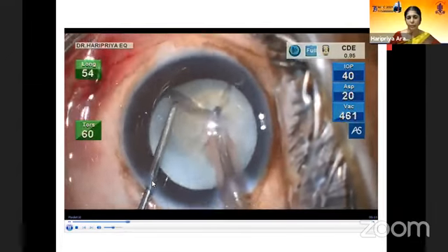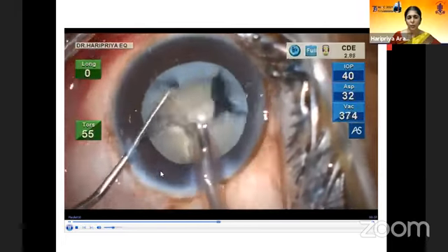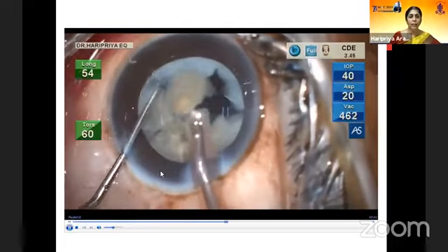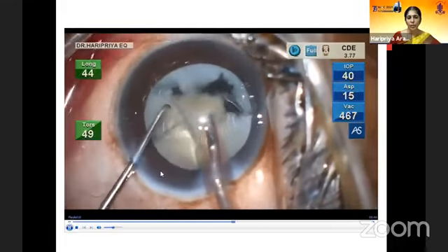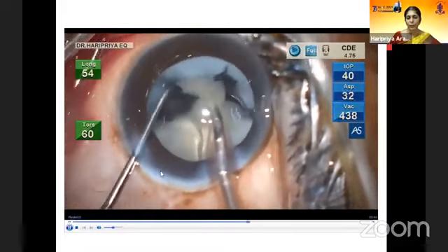There's a higher chance of PC trampolining during the emulsification, and it is also more difficult for us to have control during the chop phase. So you want to have a very stable anterior chamber here. The torsional is at 60 using the Ozil technology. I do not use any longitudinal phaco, but the one which has kicked in is because of the Ozil IP, which kicks in when I use about 90% vacuum.